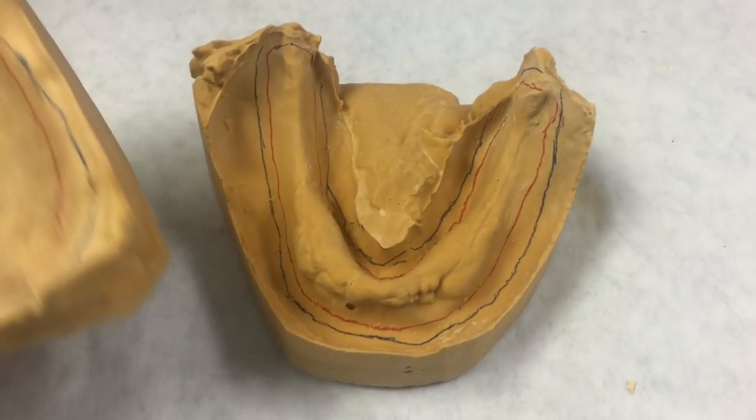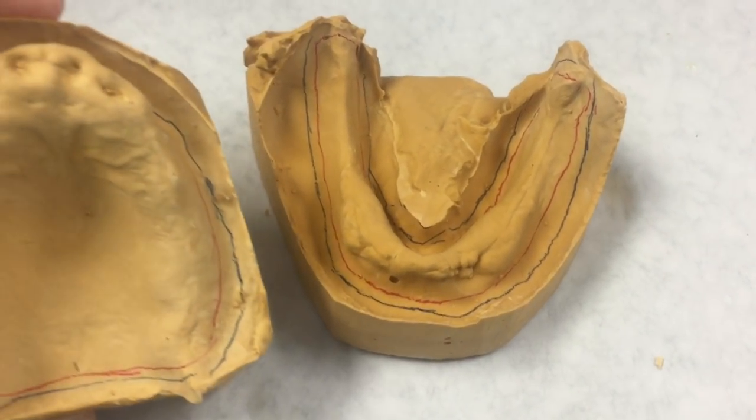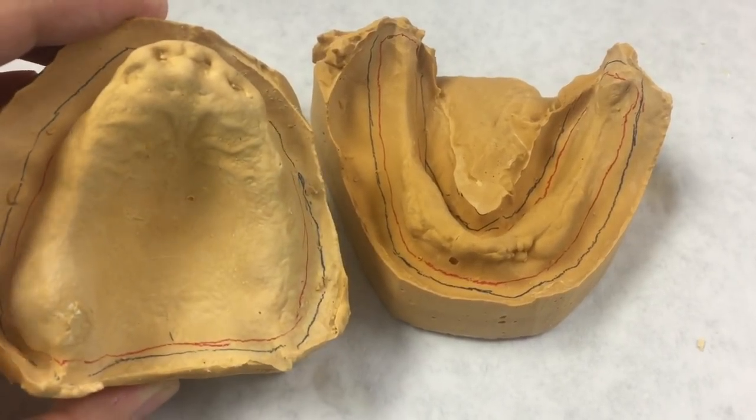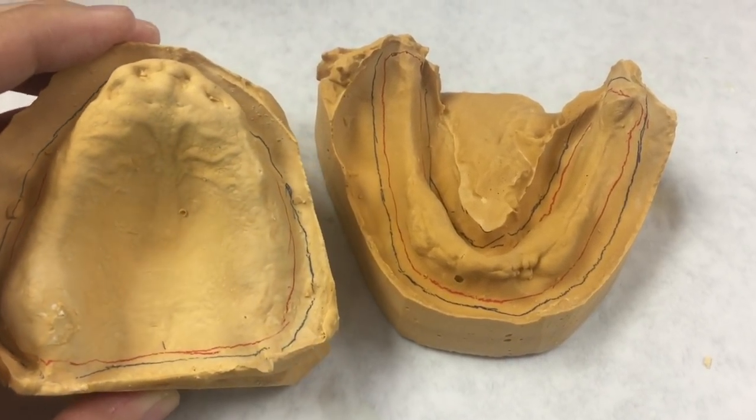The borders are considered the most important part of the denture because they are essentially what allows the denture to stay in place in the patient's mouth.